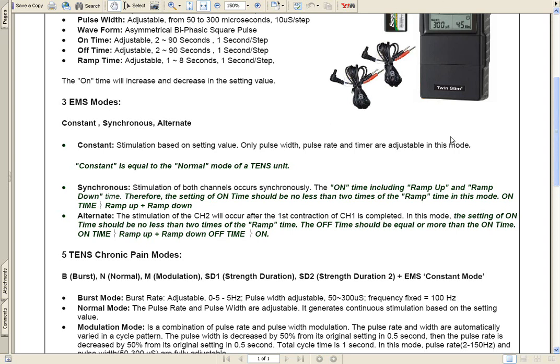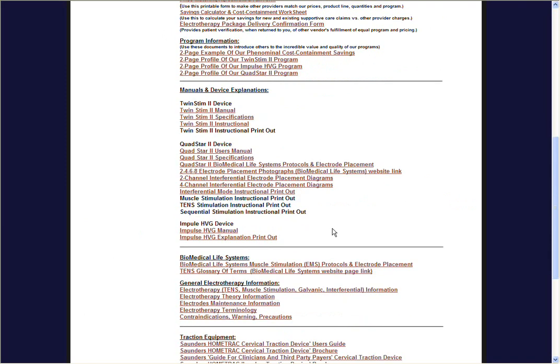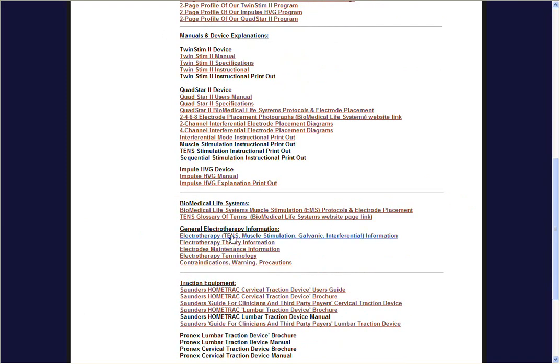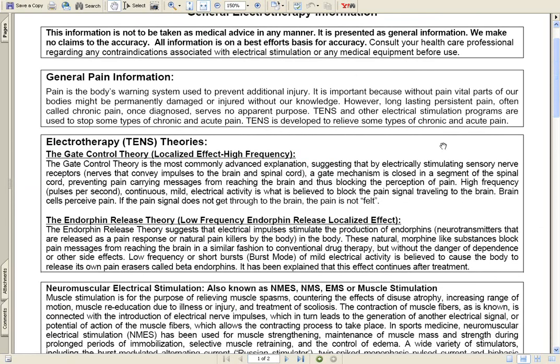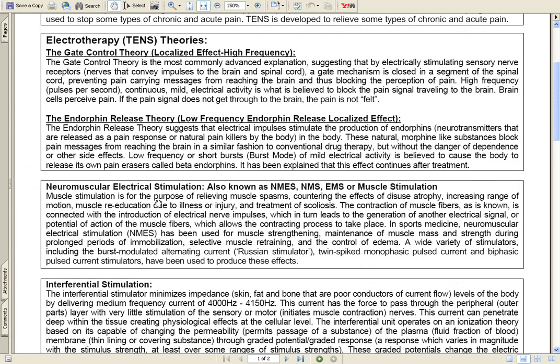So we'll get out of this, and we're going to go over to the document you might be familiar with, general information. And we're going to go down to neuromuscle stimulation. Muscle stimulation is for the purpose of relieving muscle spasms, countering the effects of disuse, atrophy, increasing range of motion, muscle reeducation due to illness or injury, and treatment of scoliosis. It's used a lot in athletics.